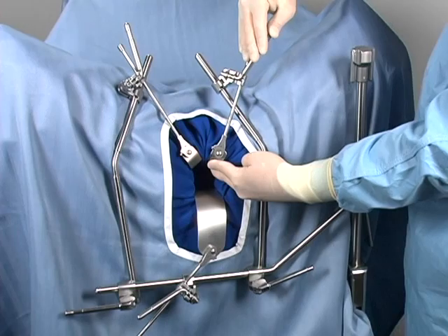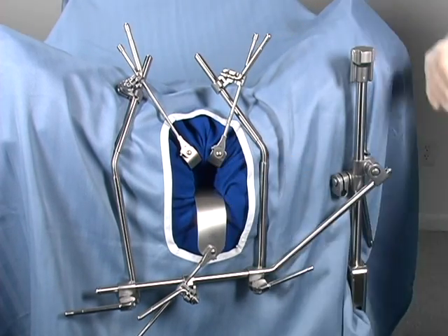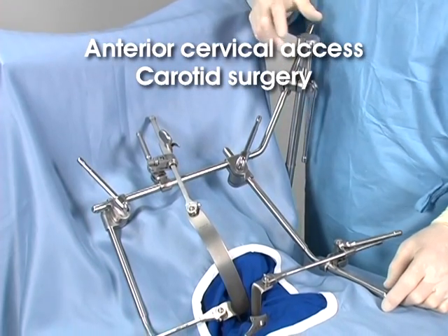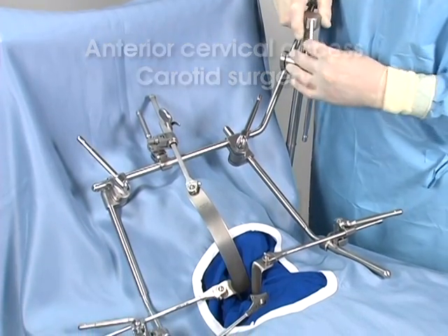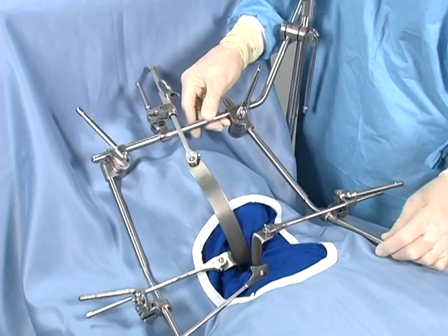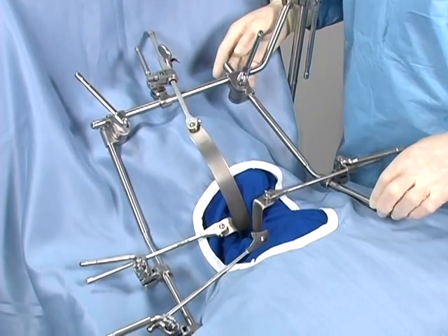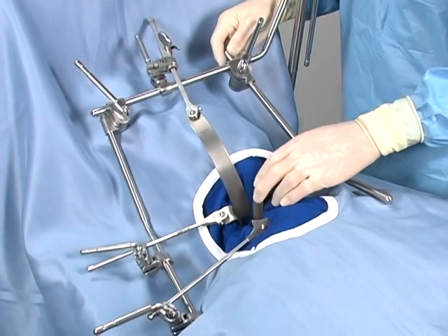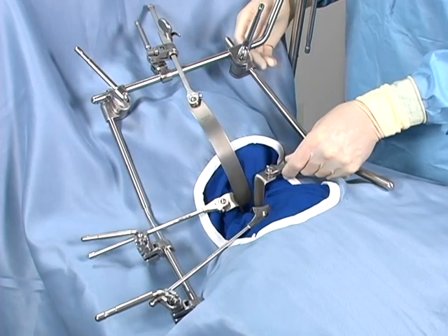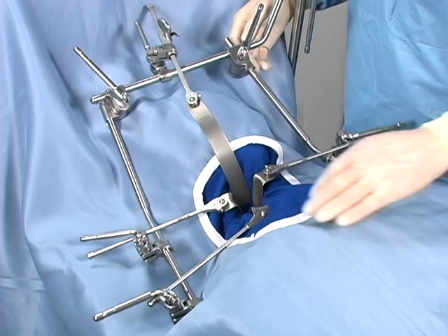The swivel feature allows a blade to be positioned for elevation, giving the surgeon uncompromised, hands-free exposure. For anterior cervical access as well as carotid surgery, the frame can be mounted at the head of the table. The crossbar should be positioned above the patient's face and the lateral arms positioned for low-profile lateral retraction. The ability to independently adjust the extension arms can be critical with this access, as the surgeon may have more aggressive retraction on the esophagus and more gentle retraction on the carotid side.